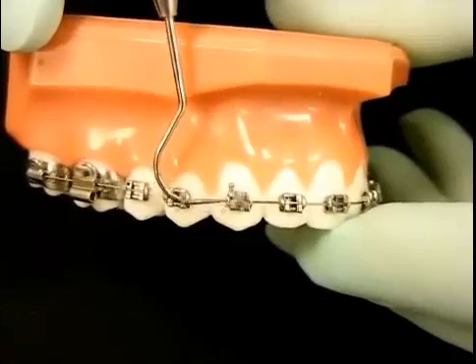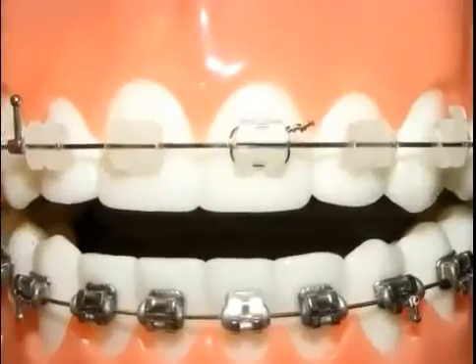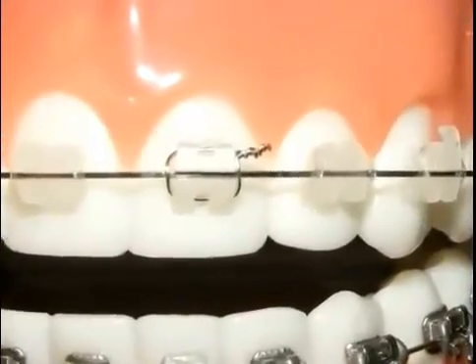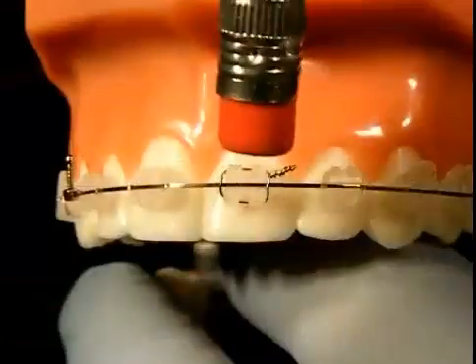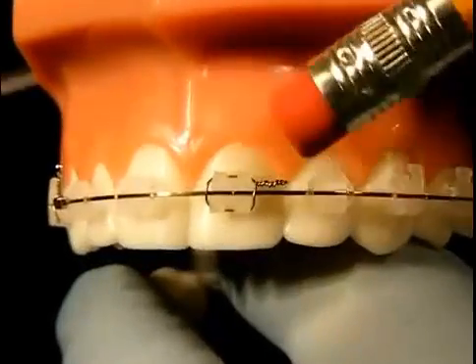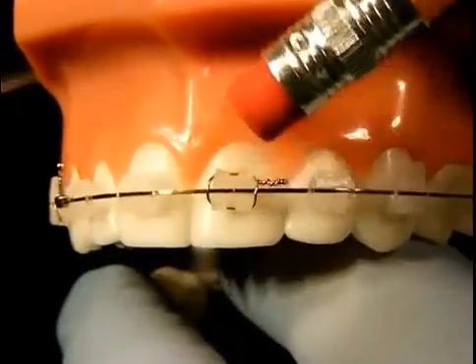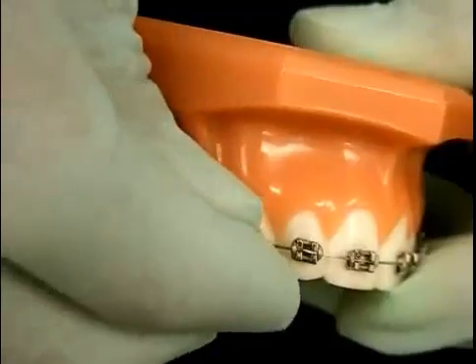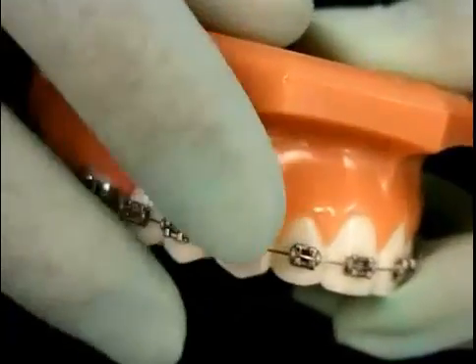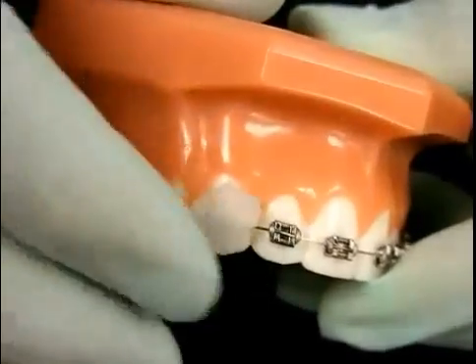Sometimes during eating or brushing, a metal tie wire can accidentally be redirected and cause irritation to your lips or cheeks. You can try to push the protruding wire back into place by using the eraser at the end of a pencil. If that is not possible, you can place wax on the area causing the irritation until you can be seen by your orthodontist to have it fixed.